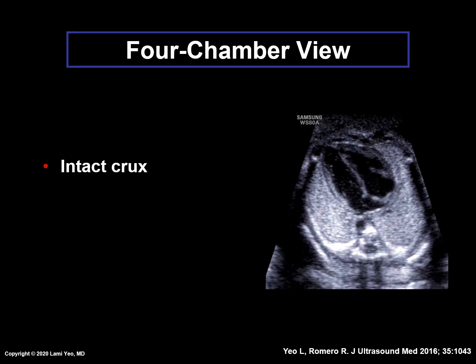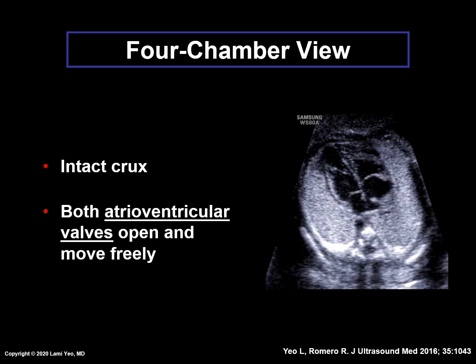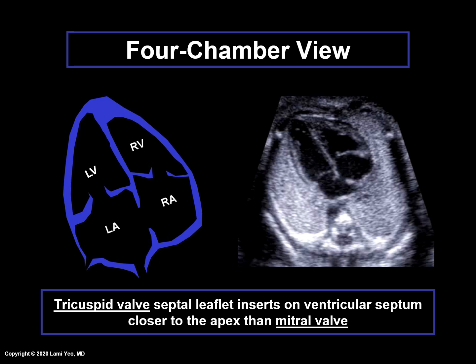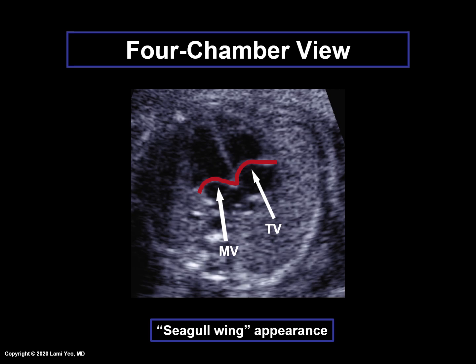The crux should be intact. Both atrioventricular valves should open and move freely as seen in the video clip. Normally, the atrioventricular valves are offset in which the tricuspid valve septal leaflet inserts on the ventricular septum closer to the apex, as shown by the red arrow, than the mitral valve as shown by the white arrow. This is also known as the seagull wing appearance of the atrioventricular valves since they are not located at the same level.